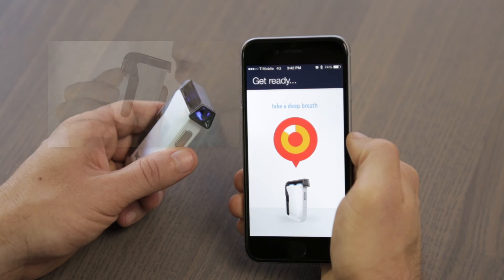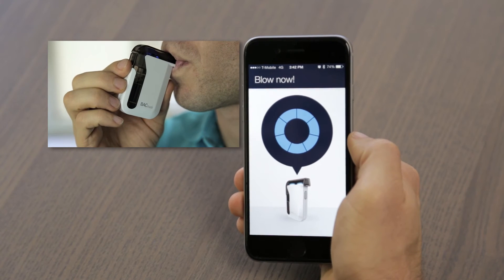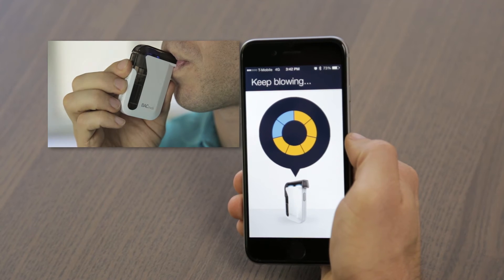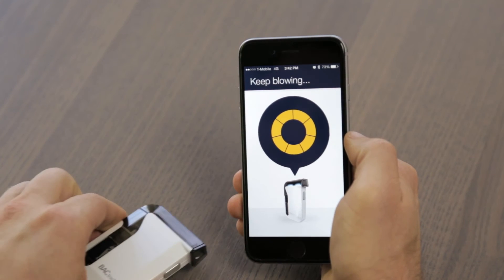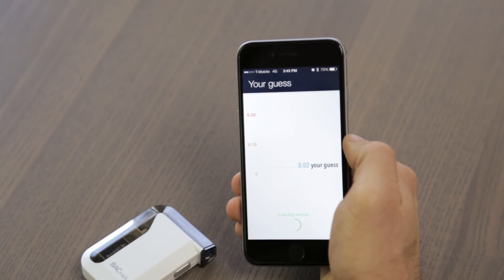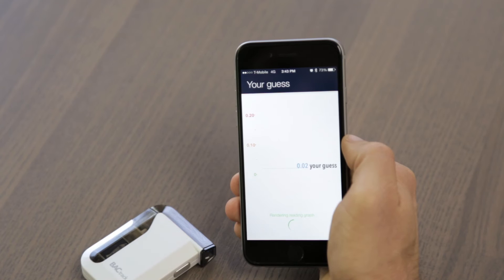You are then prompted to take a deep breath, and now you're ready to test. A long, consistent blow is best. There is a miniature air pump inside the mobile that activates at the end of each breath sample. You can actually feel the click at the end of your test. This proprietary breath capture system ensures that only a precise breath sample enters the alcohol sensor, while ambient air and external pollutants are kept out.